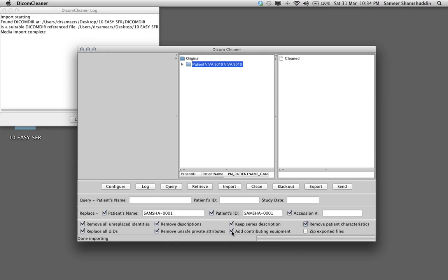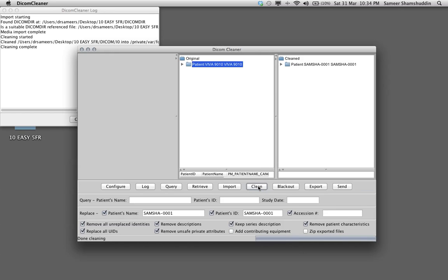And also uncheck this box add contributing equipment so you don't know from which hospital it has arrived. So all I have to do now is click the button Clean. You can see that this case has been renamed and cleaned as SAMSHA-0001 SAMSHA-0001.